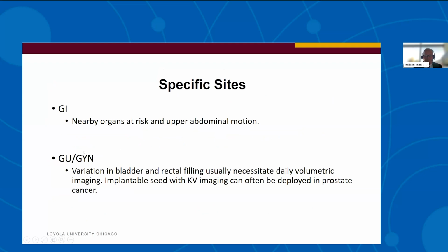GI, again, talking about nearby organs at risk and upper abdominal motion, and we talked a little bit about variations in bladder filling for GU and GYN. So the justification of imaging is very important, and it is something we use on a daily basis in clinical radiation oncology.